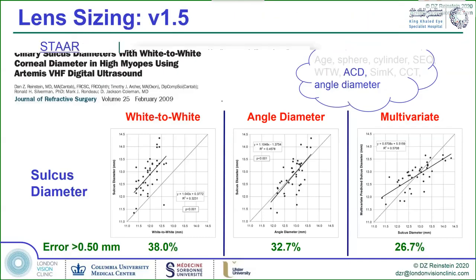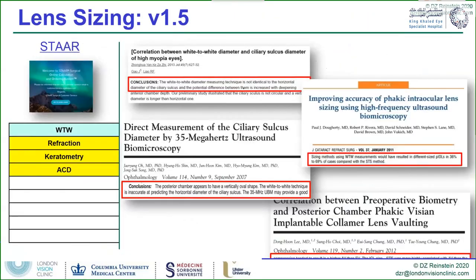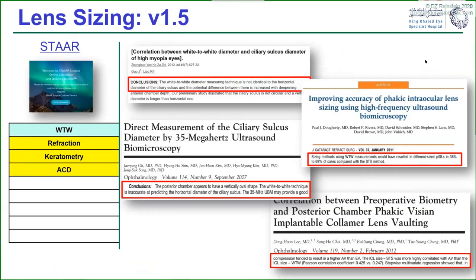So I'm sorry, this is loading quite slowly. But as I've said, the power users of the ICL, generally speaking, use ultrasound to size their ICLs. And that's, I think, a sort of a testament to the fact that there's something to be had in there.